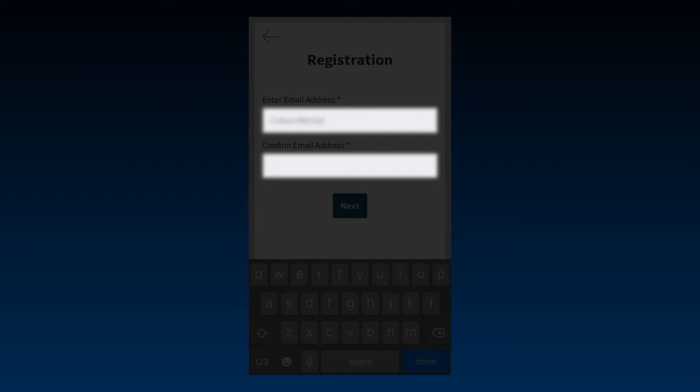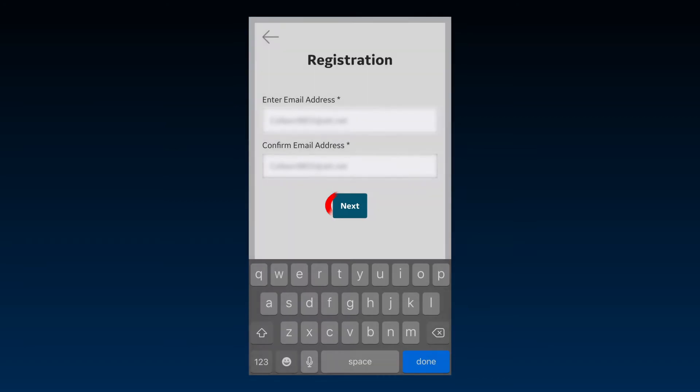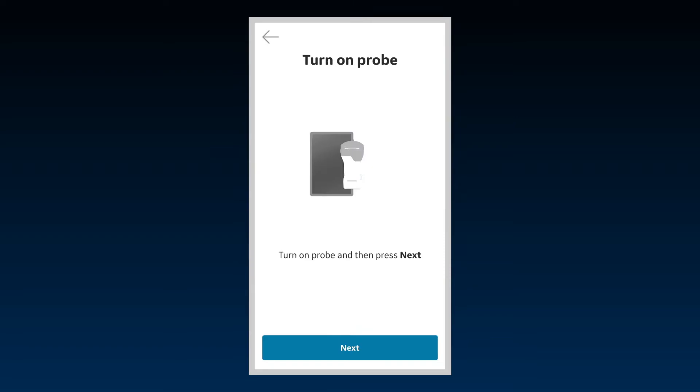The system will check to see if a registered account already exists for this email address. If not, you can proceed with registration by selecting Next. If an account is found under the entered email address, you'll be prompted to enter a new password.